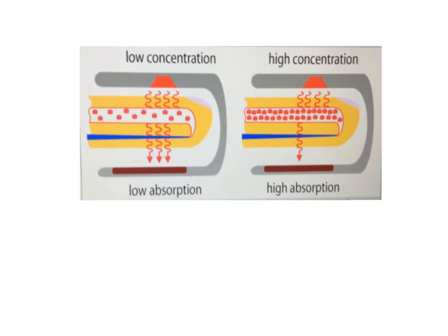So at last, we can see that light wavelengths are very short. One is 650 nm, and the other one is longer, 950 nm. Nm is nanometers. So, oxyhemoglobin and deoxyhemoglobin absorb light in a different wavelength and in a specific way.